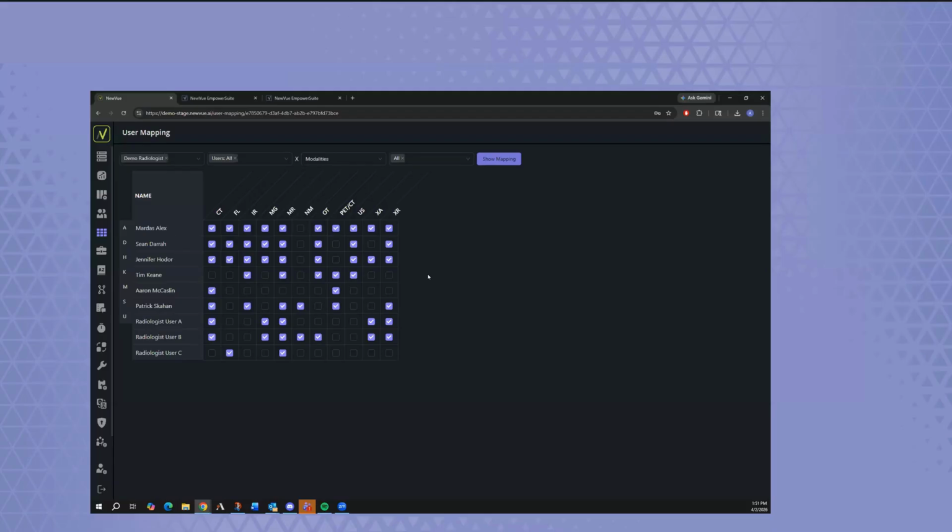And so to solve a simple problem like you have 2 radiologists who both read ultrasound, but one of them doesn't read prostate and thyroid procedures, which is fairly common, we wanted to make sure that the user is a component of any filter set that we use when we're configuring the application. So number 1, we talk about data management fault tolerance.